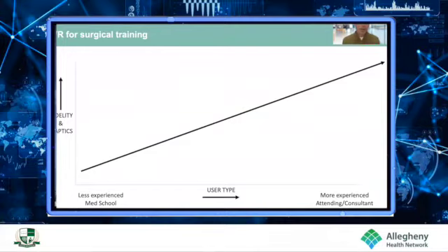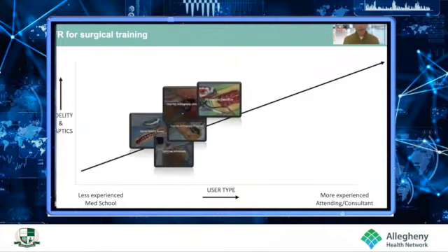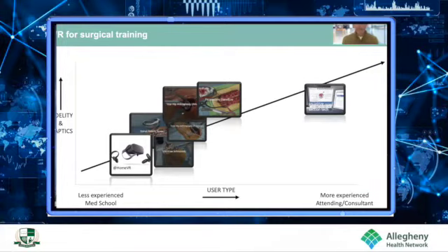Now, what sort of VR is good for what types of use cases? Well, if we just look at it from this standpoint, going from very inexperienced through to highly experienced, there's a number of different types of VR you can use. The core systems, in that mid-range of learning and refining skills, work very well with a combination of VR and haptic. At the entry level, you might be using a slightly lighter weight headset that will give you procedural understanding. And at the other extreme, you might be using a full haptic system that's allowing you to really understand new techniques and develop those skills ahead of going into a human operating theatre and interacting there.